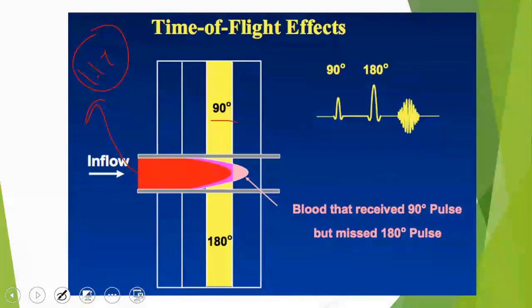Am I going to give the 180-degree pulse to provide refocusing? Essentially, the protons, which are a new entry, have longitudinal magnetization along the Z-axis. So when I give them the 180-degree pulse, I would expect a signal. But this won't give me a signal, because at that time you will flip it to the other side in the Z direction. So, who am I working with here?